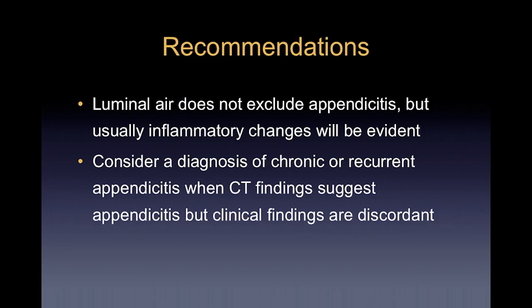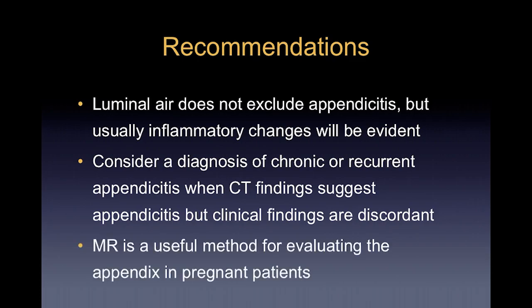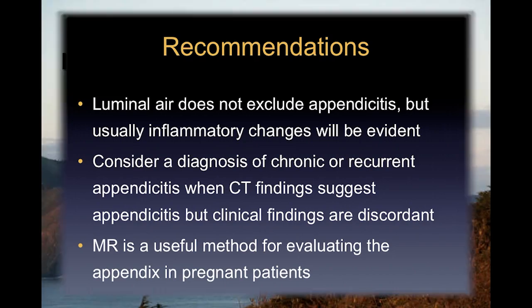And remember to consider a diagnosis of chronic or recurrent appendicitis in those unusual cases where CT really looks like acute appendicitis, but clinical findings are discordant. And lastly, remember MR as being a particularly useful method for evaluating the appendix in pregnant patients.